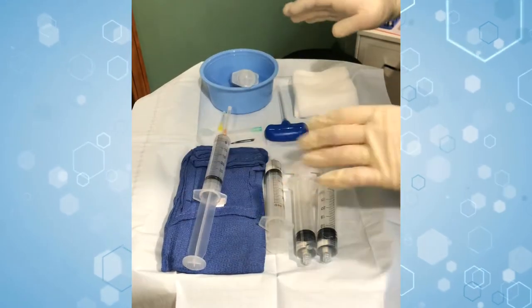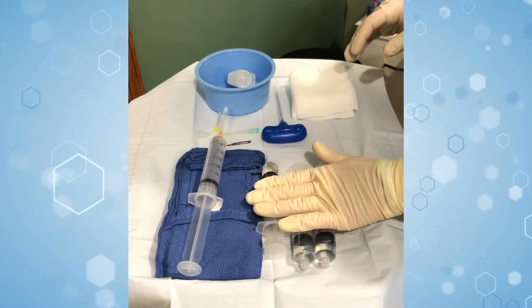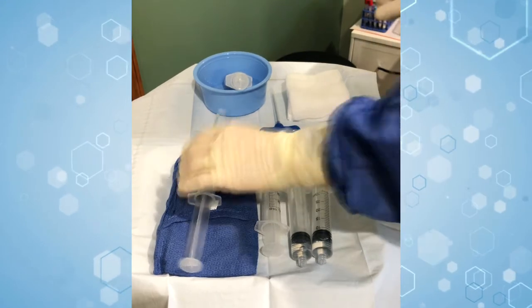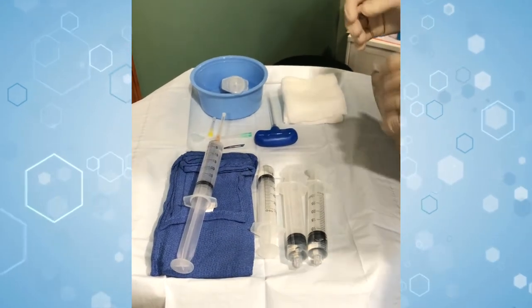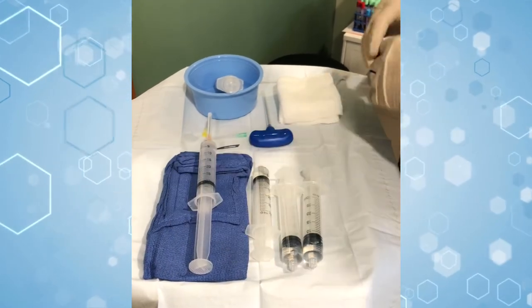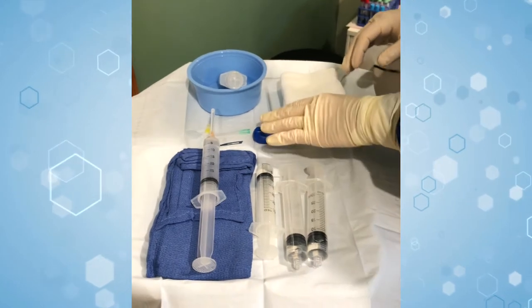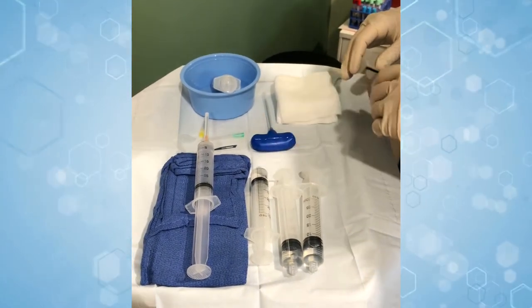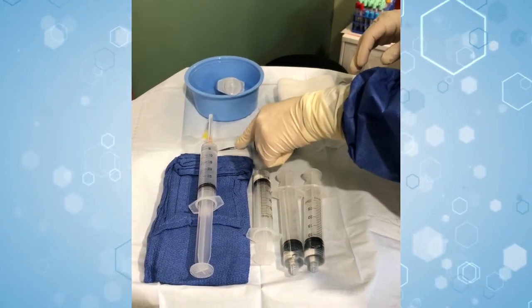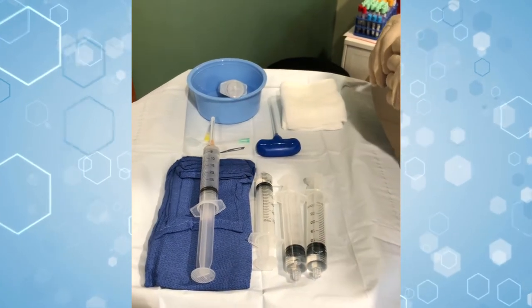So this is the setup we're going to use for the procedure itself. We're going to draw three syringes full of bone marrow. This is going to be our numbing medicine. You'll notice the patient is not going to be sedated or anything like that — it's going to be totally comfortable just by using some numbing medication. A lot of people think they need to be knocked out, but that's totally unnecessary. This is the instrument we're going to use to actually extract the bone marrow — it's called a Jamshidi trocar. And we're going to make a very tiny small incision with this blade, probably about two millimeters wide.